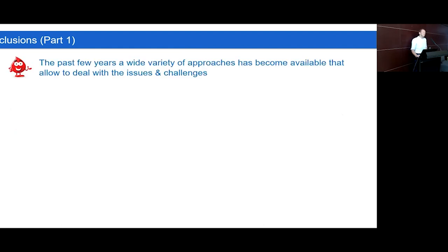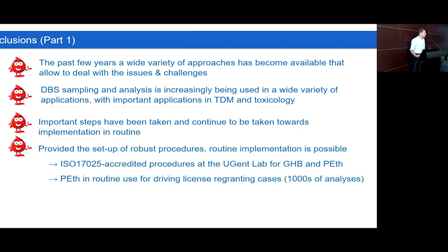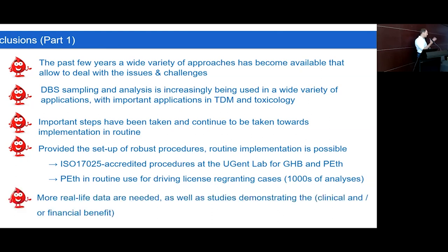Then there's a wide variety of approaches that has been developed the past few years. It's increasingly being used in both TDM and in toxicology. Important steps have been taken towards implementation in routine. We run several accredited procedures in our lab, for instance for GHB related in toxicology and PEth. Last year, we've done several thousands of analyses on PEth in microsamples. We get samples even from the UK, sent to us on a weekly basis, which is quite convenient because there's no dedicated sample transport. It's just a regular FedEx package with these dried blood microsamples.